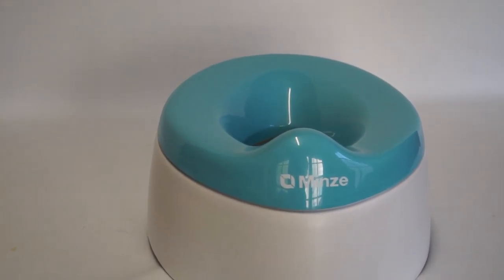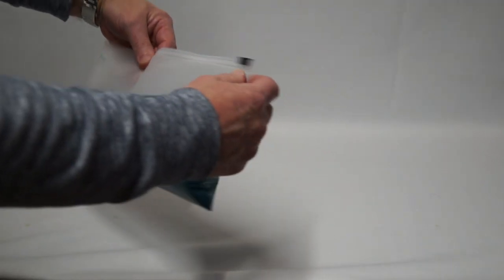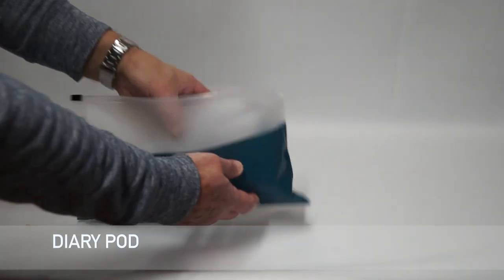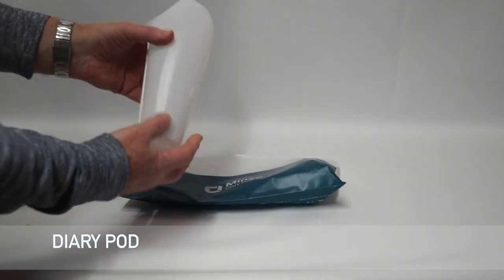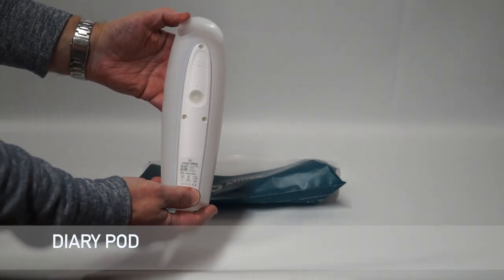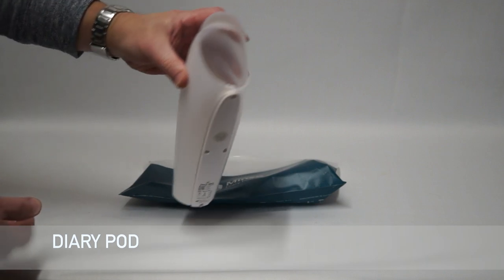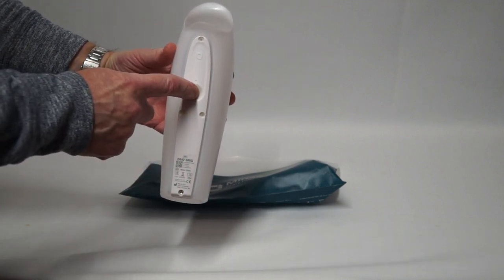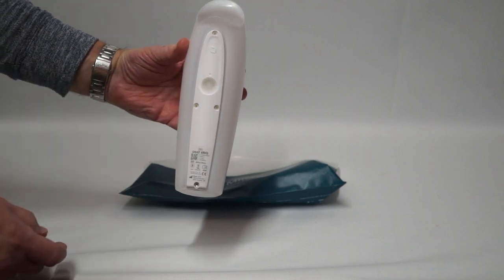For clinicians who want their patient to create a diary of events, the diary pod is used. This can be used by both men and women and toilet-trained children, and it will record the time and volume of urine that is passed. It works in conjunction with the Minze app that can be downloaded onto a smartphone.